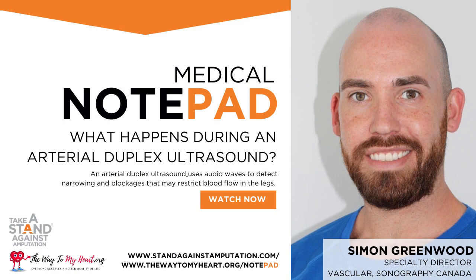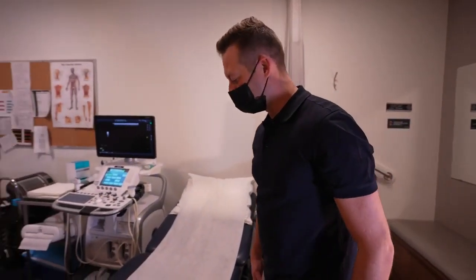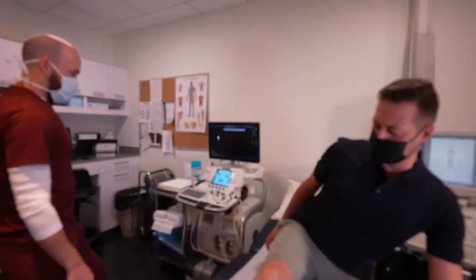Medical notepad. And today we're going to talk about what you can expect when your doctor orders a vascular ultrasound. A patient would typically arrive at the reception area, have a seat in the waiting room, and get called through for their ultrasound exam. And when they enter the room, they'll be greeted by the sonographer performing the test.